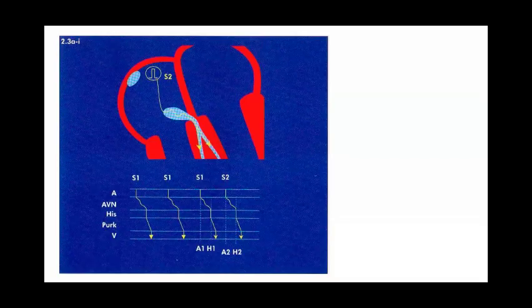It's very important. The second important thing is that with atrial pacing, many forms of tachycardia will be induced. And this induction of tachycardia is very important. I can't ablate the tachycardia or cure the tachycardia if it's not inducible. I need to induce it to see where it comes from and determine its ablation target.